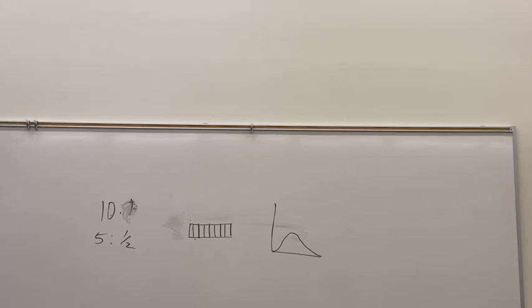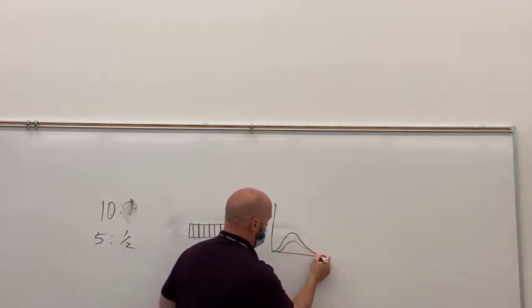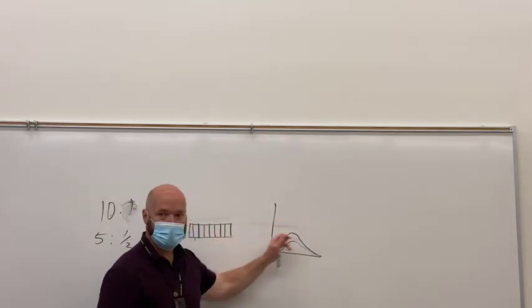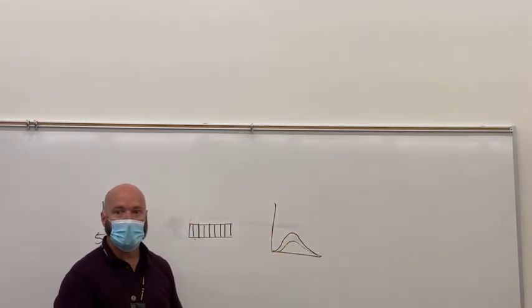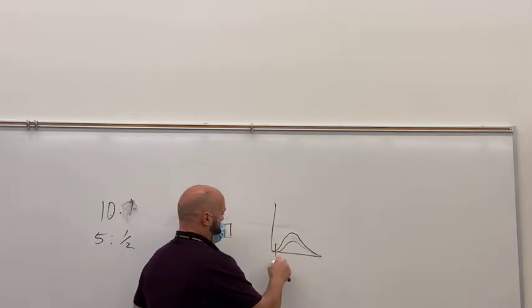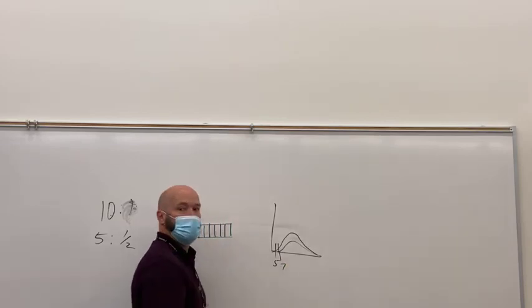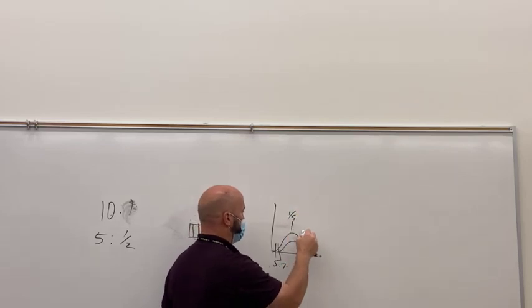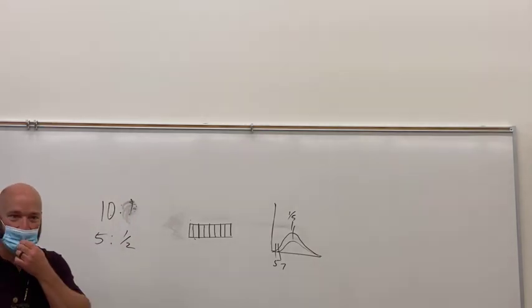But if you increase filtration, your new beam spectrum is going to look like this. So the peak energy doesn't change, the numbers decrease, the average increases, and the minimum energy takes off at a later point. If your minimum energy was 5, here you've got a minimum energy of maybe 7. If your average here was 1/3, it may be slightly higher than that, pick a fraction.